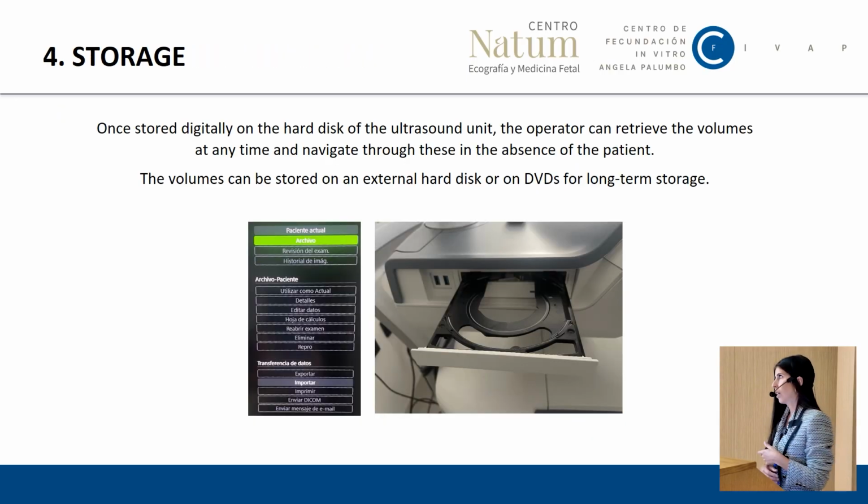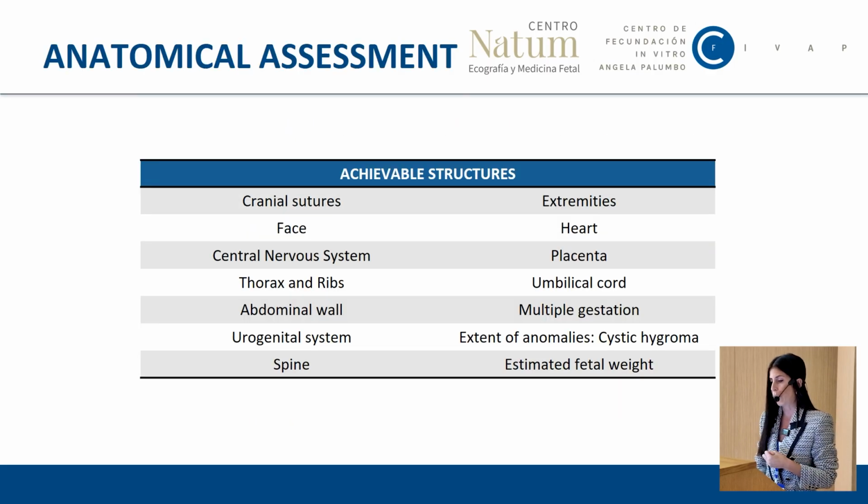And finally, after the display modes, after manipulating the images, we can also store them. Once stored digitally on the hard disk of the ultrasound unit, the operator can retrieve the volumes at any time and navigate through this in the absence of the patient. These volumes can also be stored on an external hard disk, USB stick, or on DVDs for long-term storage.